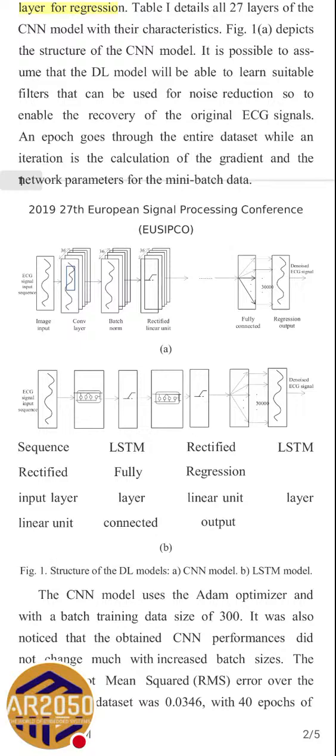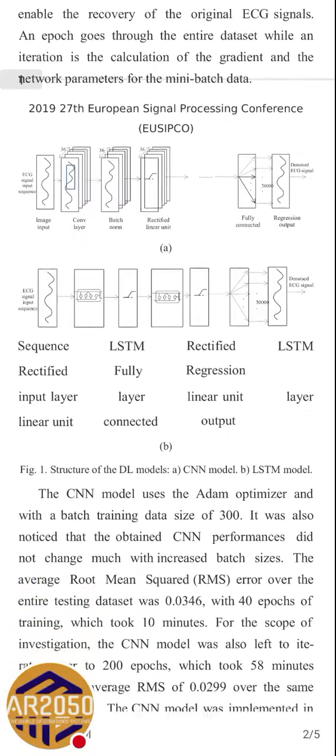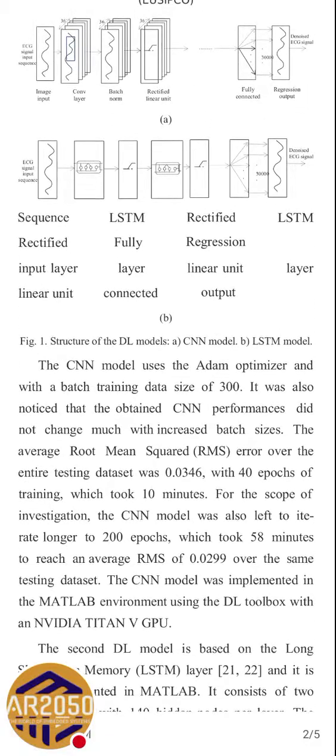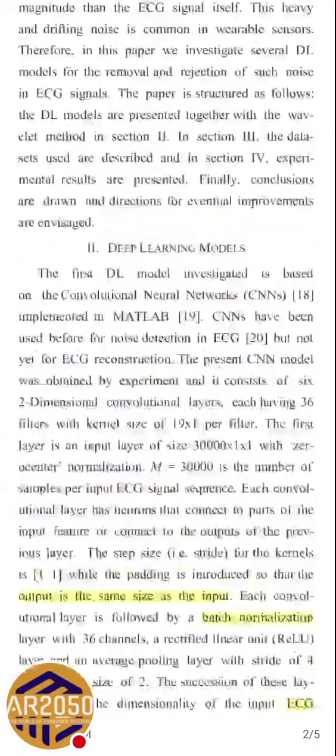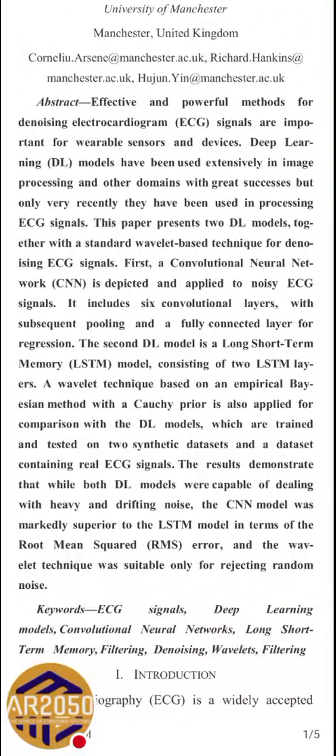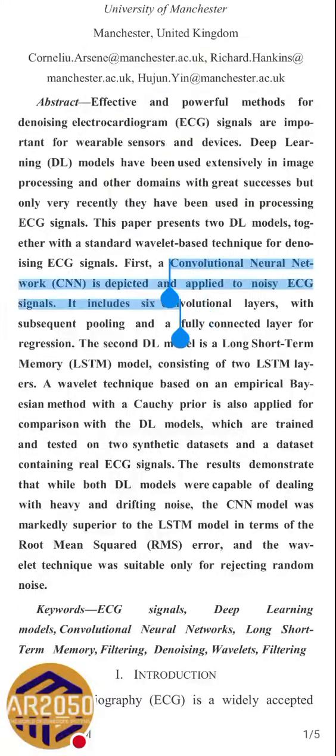and a regression output. They also created an LSTM based model, but we are not going to discuss the LSTM based model. We will simply keep our focus on the CNN based model, and we'll come back to the LSTM once we fully grasp the concept of CNN applied to our denoising.